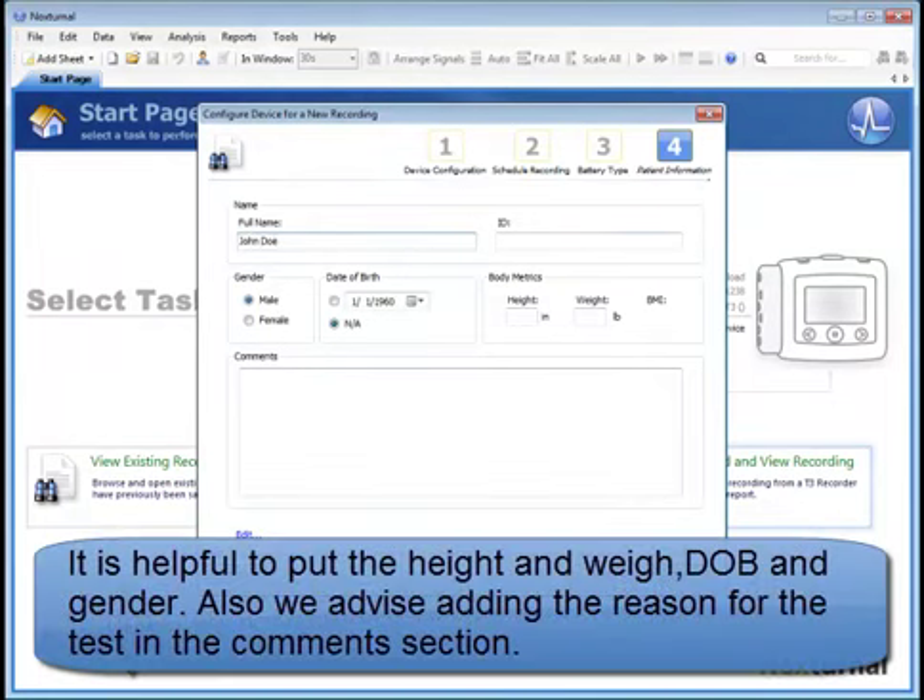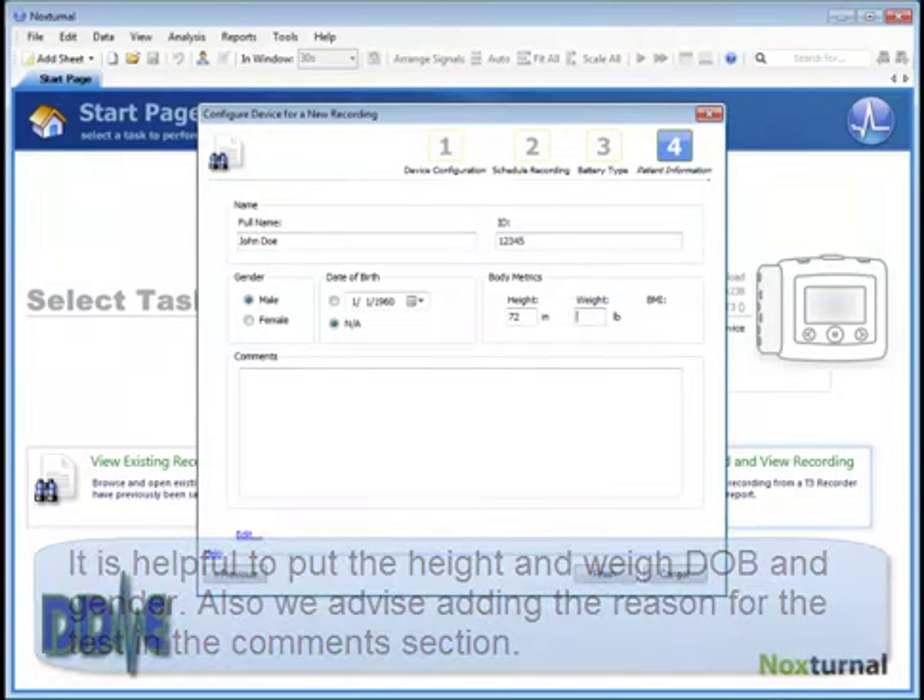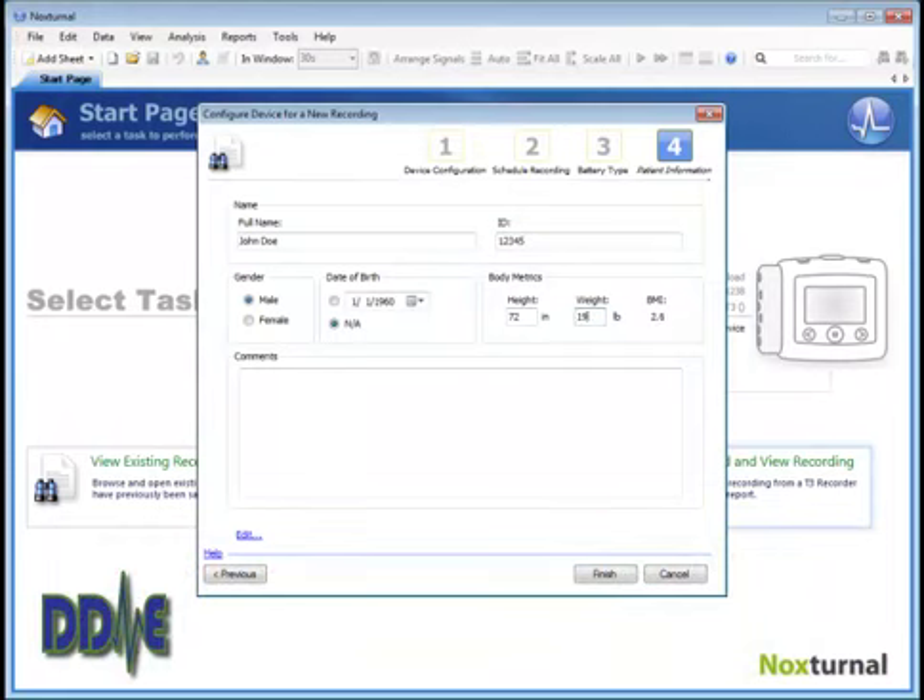Optionally, you can fill out height and weight — we highly recommend this because it helps with the process. We also recommend in the comments section putting some information about why we're doing the test.